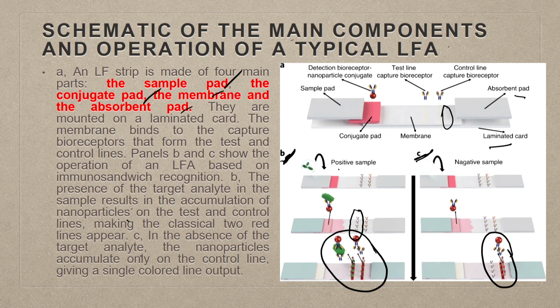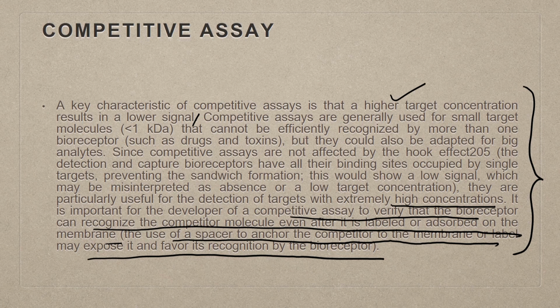So, that is why it is of extreme importance that we have a positive control and a negative control in all these kinds of tests, so that we get a clear understanding about how these binding assays are being evaluated and quantified, without getting into the aspect I was mentioning of oversaturation. This oversaturation aspect has to be avoided at any cost.